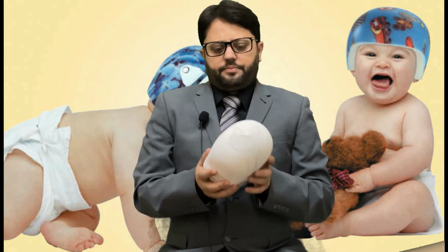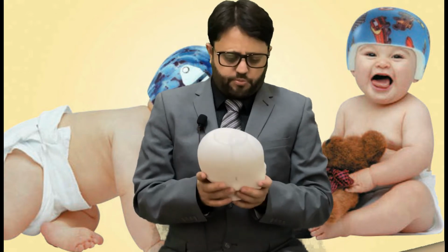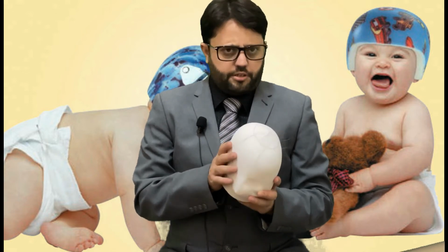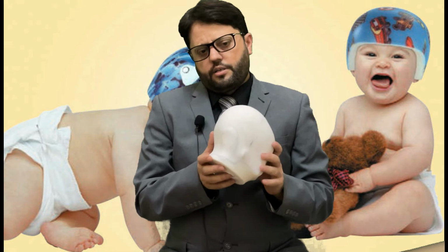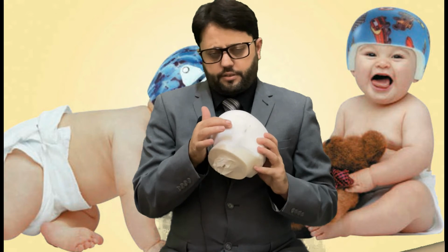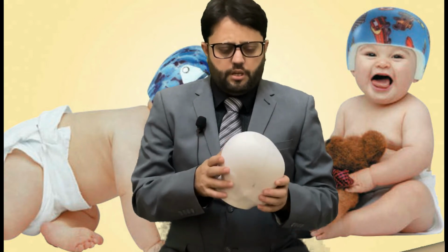In addition to these, there are some other problems. For example, if a baby is born with a hydrocephalus head, the doctor will do an operation and put a shunt inside. In this case, for example, this was one of my patients, and he has a shunt in this area. So you will see a prominent marking here. If the patient has a different kind of medical condition, then we need to deal accordingly.